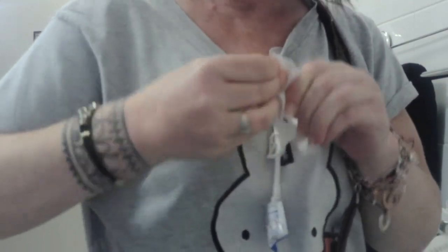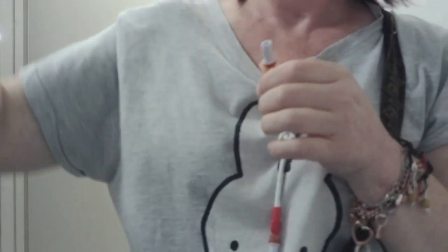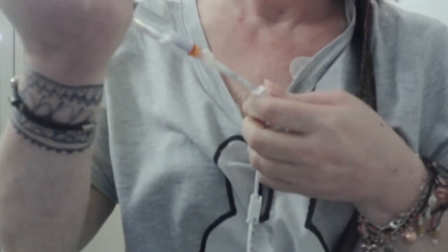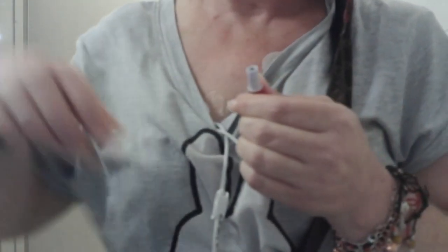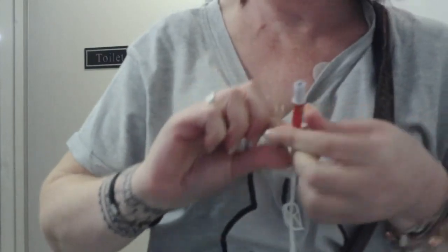That little wipe. I'm going to go back to this one because it was done first and I want to get it aspirated. I want to get it flushed now. Undo that. I'm just going to push that in to make sure these are not knotted underneath, otherwise it makes them difficult to flush. And I move my clamp up and down so that it doesn't just get stuck in one place, because it's always clamped. That's that one done. My cap back on that. Jobbed.